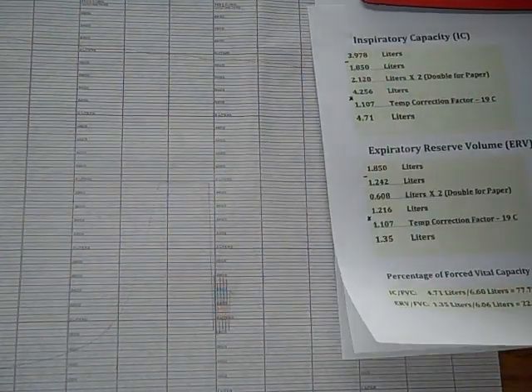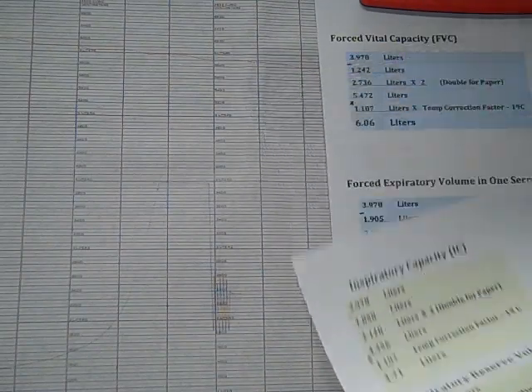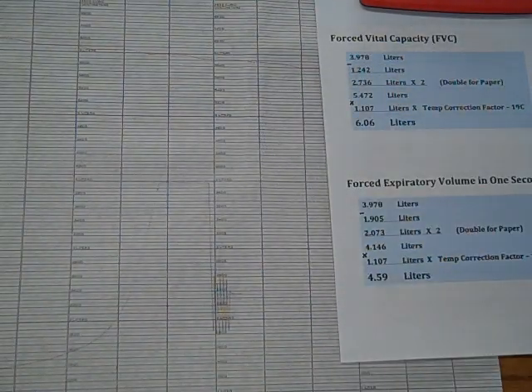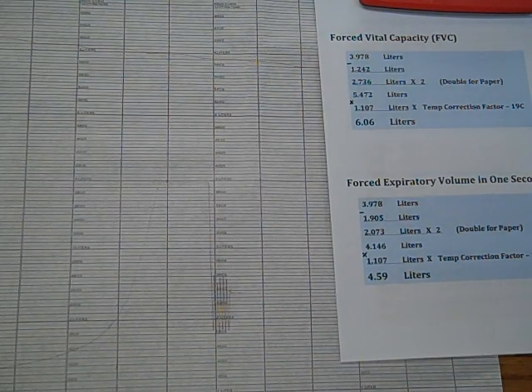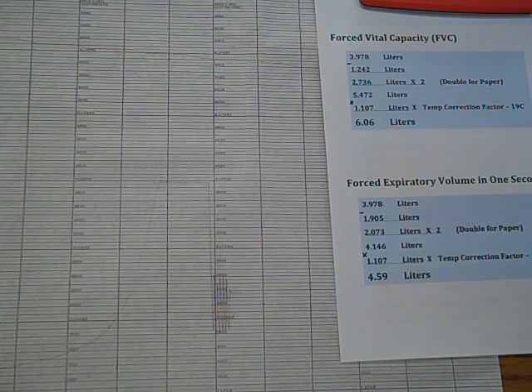Now, once we've gotten our tracing, one of the first things we want to do is look at all 3 tracings that we would typically do and determine which one has the highest combination of forced vital capacity and forced expiratory volume in 1 second. And we will note which one of the 3 tracings had the highest of each value. But we'll then take the sum of the 2, and we'll use that one for all further evaluations.